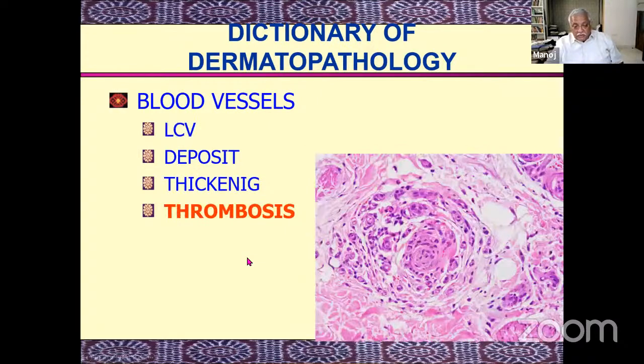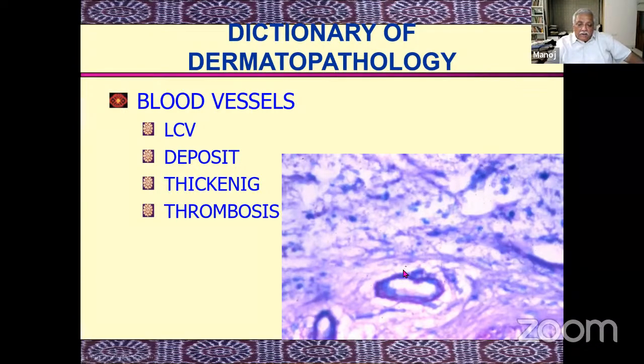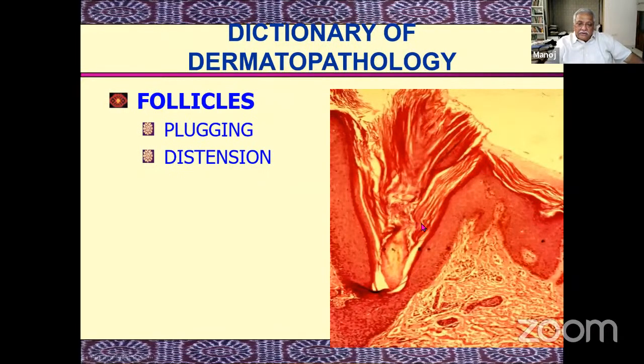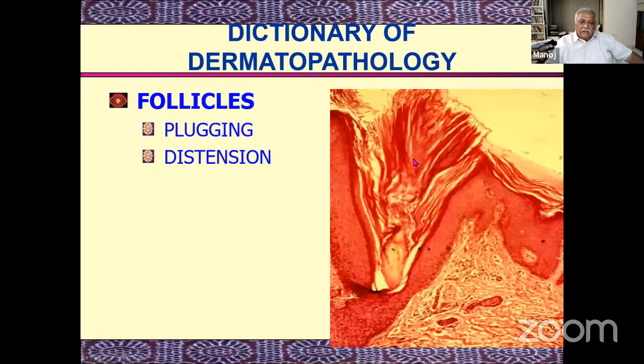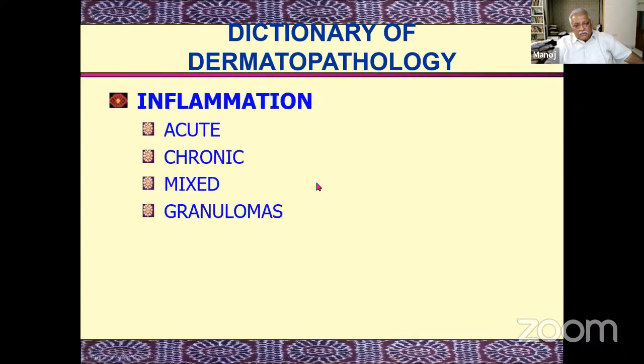We are not, again, showing you pictures of this; that will come up together too. Now, this is an organizing thrombus inside this vessel. This vessel, the medium-sized vessel, developed a thrombus, and now that thrombus is getting reorganized. A deposit, amyloid deposit around the blood vessel. A follicular plug with a lot of hyperkeratosis, parakeratosis, same thing. A sweat duct apparatus. Again, this is a hair follicle, the lower end, sweat duct. And the importance in these, of course, is that at times, because of lesions here, the sweat duct gets obstructed and then gets dilated. So blockage may occur, causing dilatation.